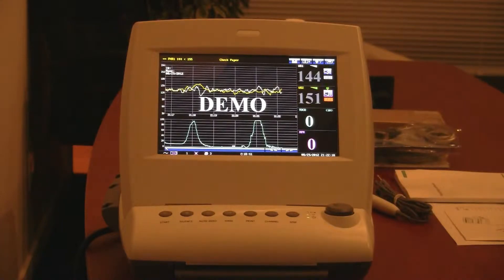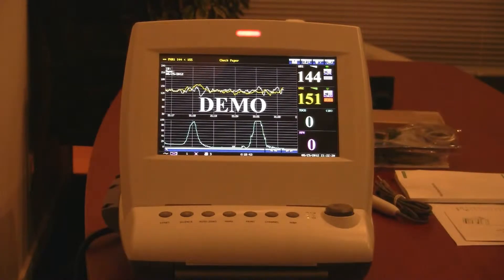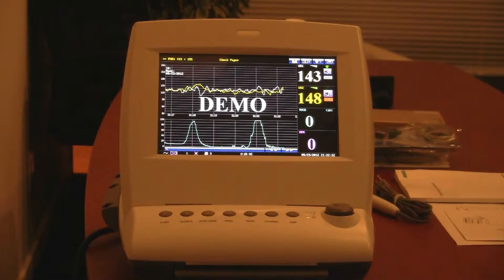Currently it's in demo mode. This unit is designed to compete in the US marketplace against the Philips FM series monitors or the GE Corometrics monitors.